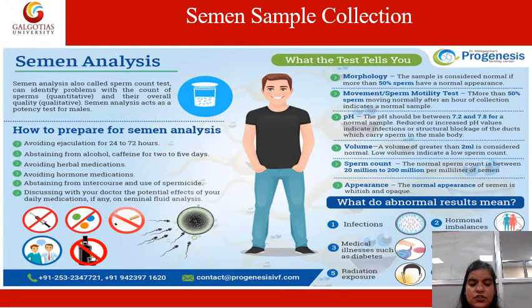These are the slides which I have covered. A lot of samples: blood collection, urine collection, stool collection, saliva collection, sputum collection, and the last one, semen collection. I hope you got to know how we can do the sample collection and how every specimen is very different from another, and how important it is to collect the sample in the right way, so that you can follow the same and also recommend the same to your patients and your family.